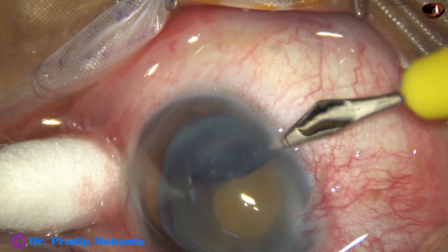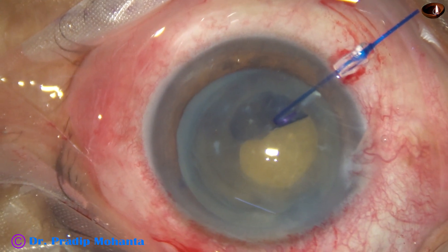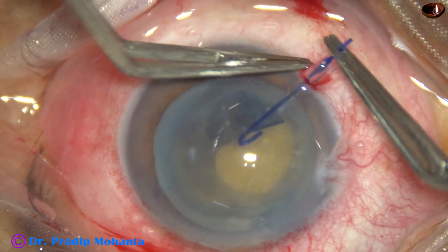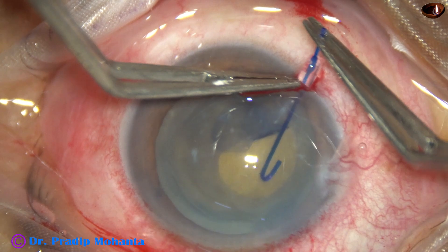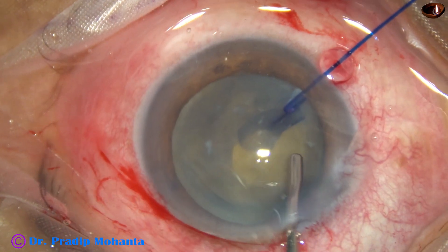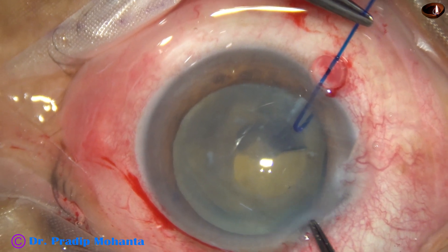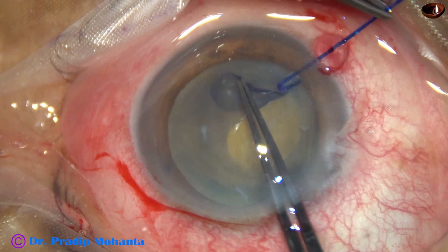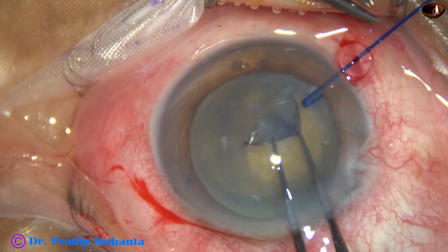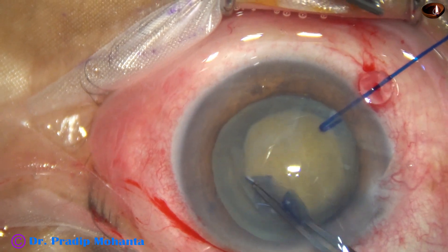So what step or maneuver can we take here? Making a small stab incision and I have asked for an iris hook — placing the iris hook just beneath the rhexis margin. This iris hook will provide counter-traction when I pull the capsular tag. So this is the maneuver you must take if some fibrous band is on the way. Inject viscoelastic again, go again with the utrata forceps, hold the capsular tag. As I pull the capsular tag, there is counter-traction by the iris hook and easily we can overcome this fibrous band. And now I complete the rhexis, ending up with a small rhexis.